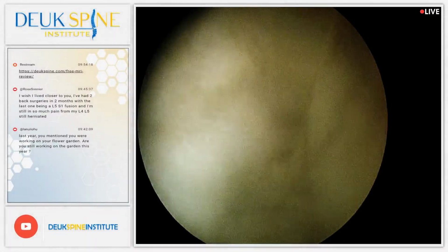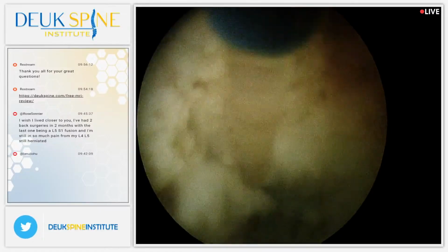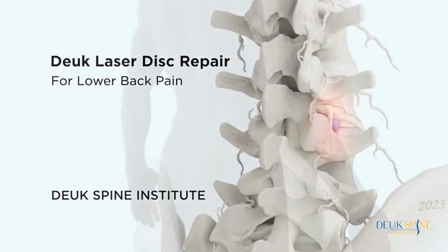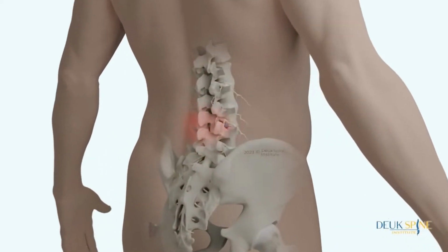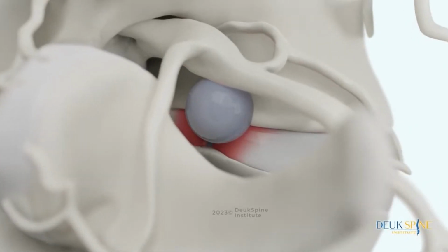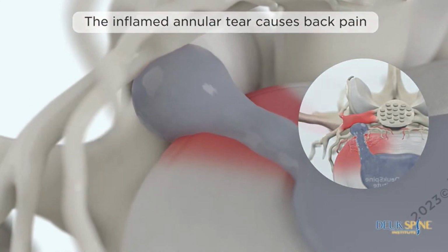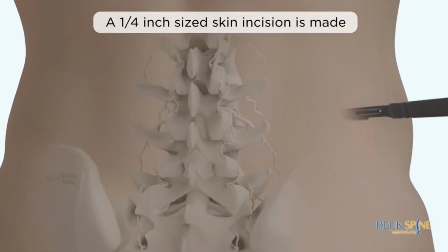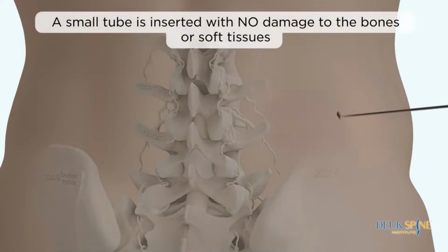Let's show the audience how the Deuk laser disc repair surgery works. Disc injuries are a common cause of chronic back pain. The inflamed annular tear causes back pain. A 1/4-inch sized skin incision is made. A small tube is inserted with no damage to the bones or soft tissues.